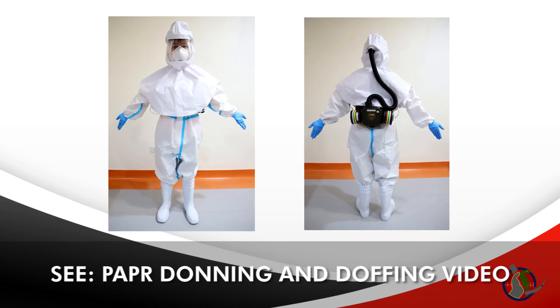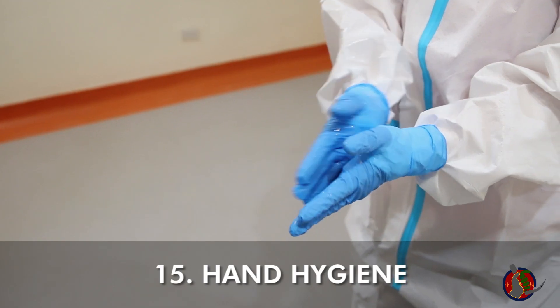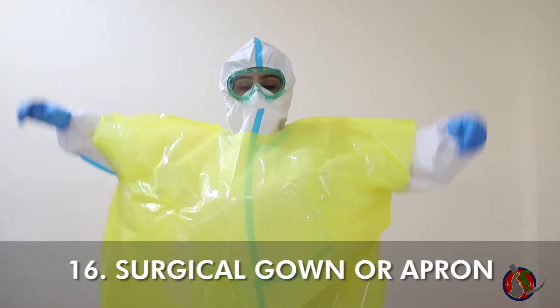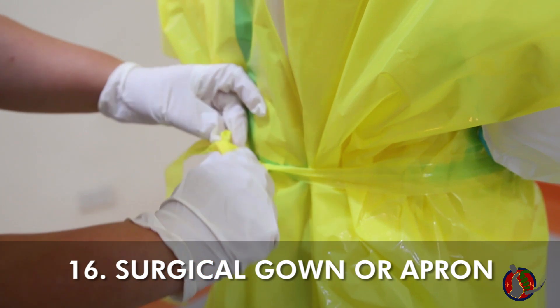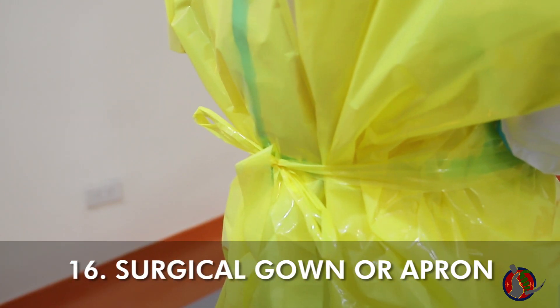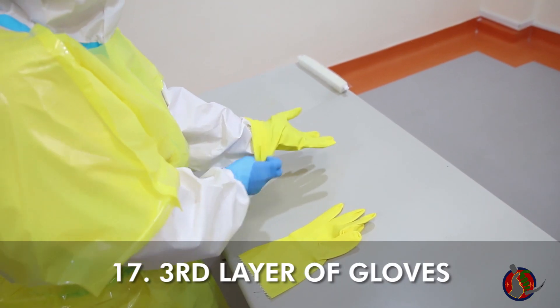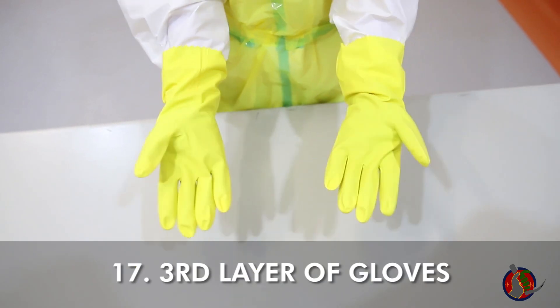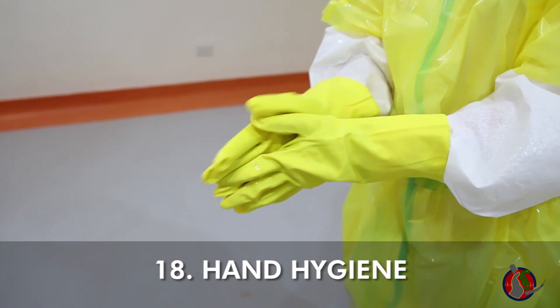The PAPR may be donned at this time. See our PAPR donning and doffing video for details. Do hand hygiene. Put on surgical gown or apron and secure by tying the ribbon at the back. Put on the third layer of gloves and pull the gloves as far into the forearm. Make sure all gaps are completely covered. Do hand hygiene.